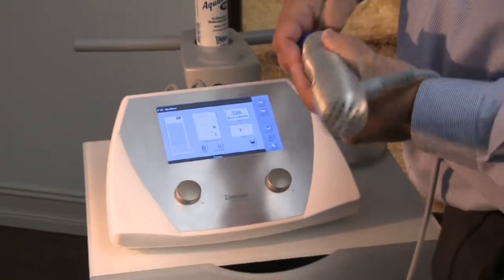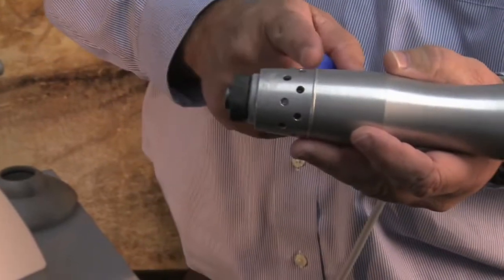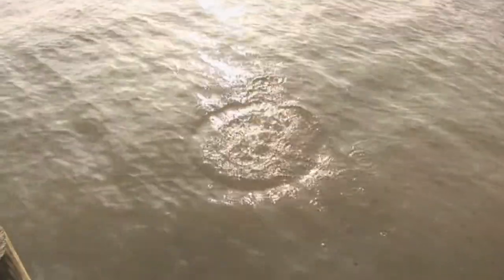Radial shockwave or radial pulse therapy is a good analogy. It's a ballistic shock or a ballistic energy delivered to the tissue, and it's like dropping a rock in a pond. So that at the point of impact you have the most energy, and it has a ripple effect outside of that impact point. Whereas traditionally shockwave is thought of as like for lithotripsy, used to break up kidney stones in the kidney, and it's like taking a rifle and trying to hit a bullseye, which would be the kidney stone. So this is a very generic or very general, more superficial treatment. I thought, if the Olympic athletes are using this, then this must be something worth doing.